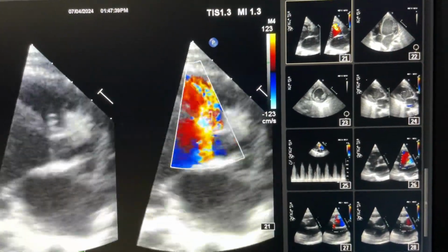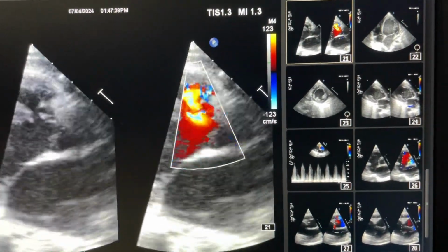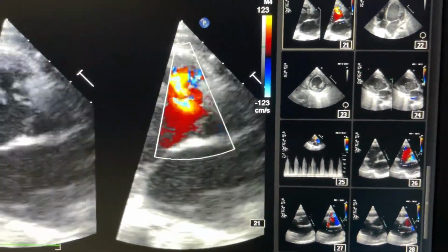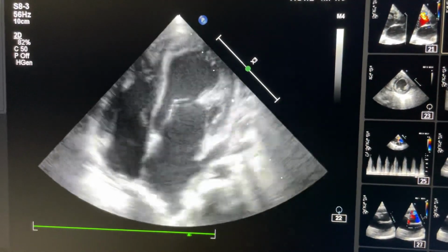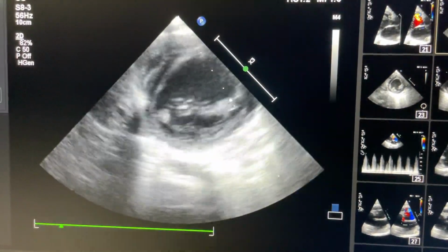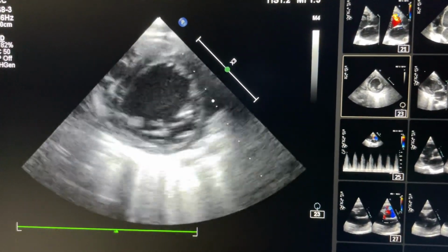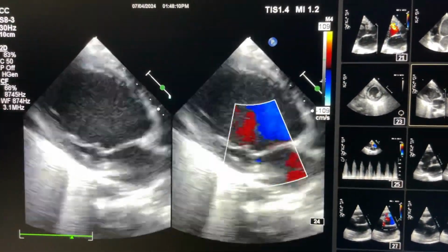This patient is child, only 1 year and 6 months old, so ultimately the child needs VSD closure. So in case of VSD, you see that the left ventricle enlarged, relatively ejection fraction is relatively low. You can say the same thing, left ventricle enlarged and ejection fraction relatively low, that is almost 60%, around 60%. It has to be more than 65%.